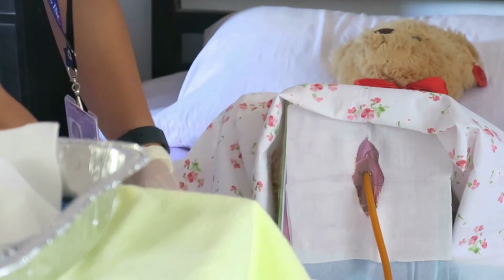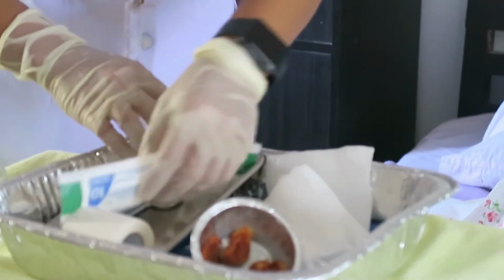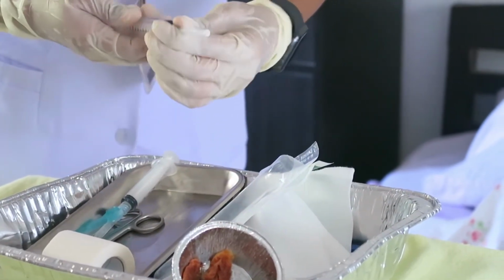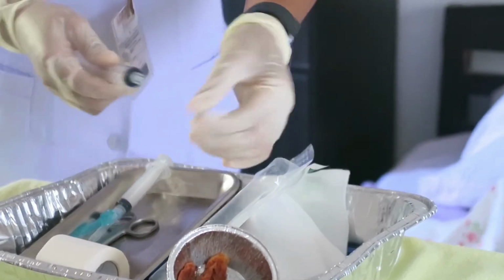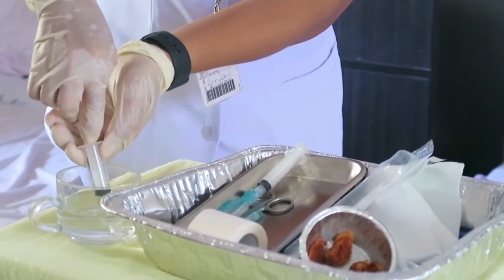So, I will get the 10 cc syringe. Then, remove the needle. Then get some sterile warm water.